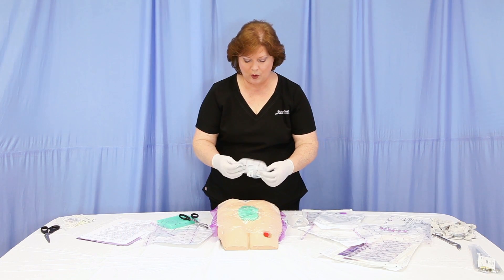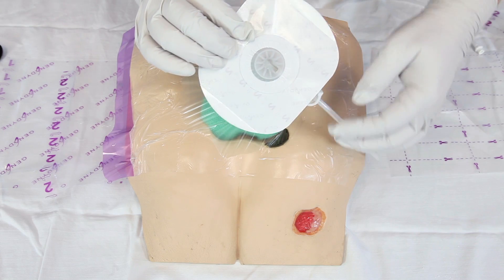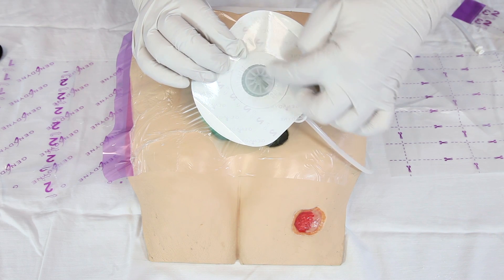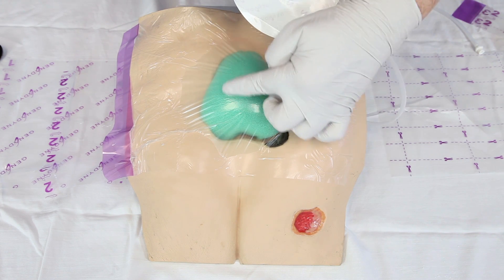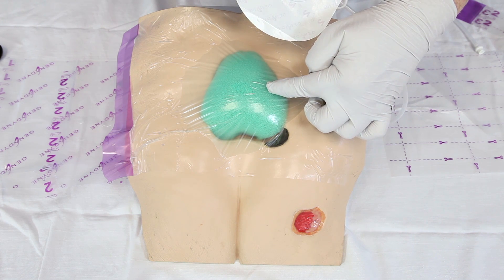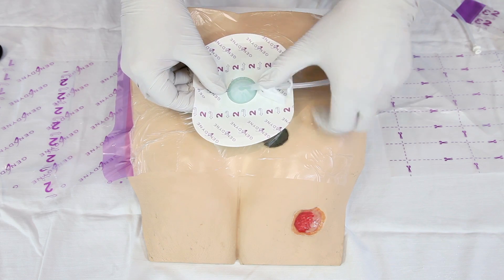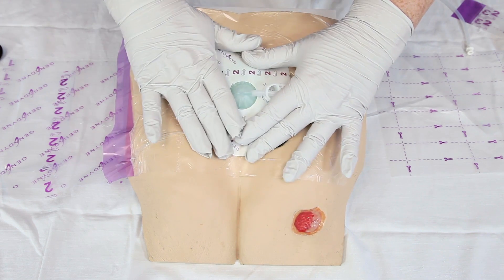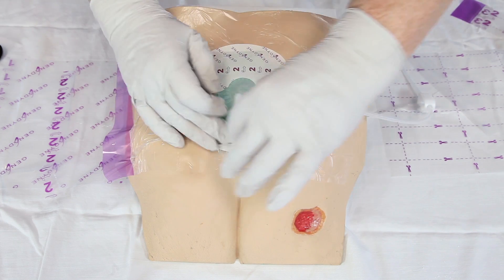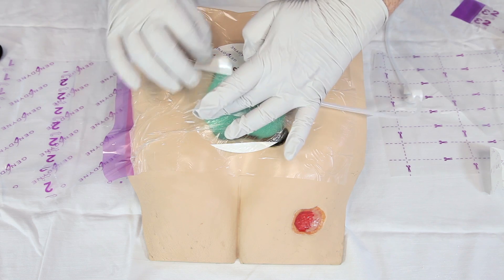Peel the backing from the port. Position the tubing for patient comfort. Center the opening on the port pad over the previously cut opening in the transparent film over the wound, and press to apply. Remove any remaining film backing from the port pad.